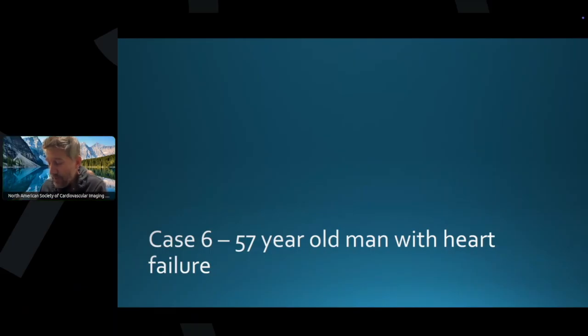I think they need from us the measurements of the orifice, but that's it to know if it's a device versus surgical approach, or do we have to give them any other information, if they can try with a device? As long as the margins of this defect are good for a device closure, they might try with a device, but in my institution, they'll probably just stay with surgery.